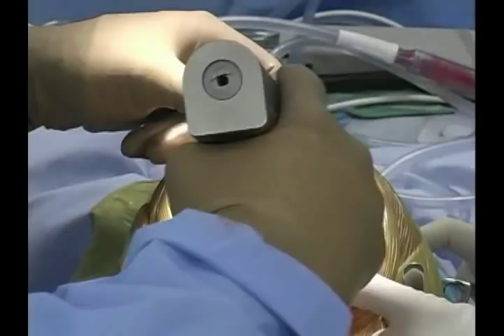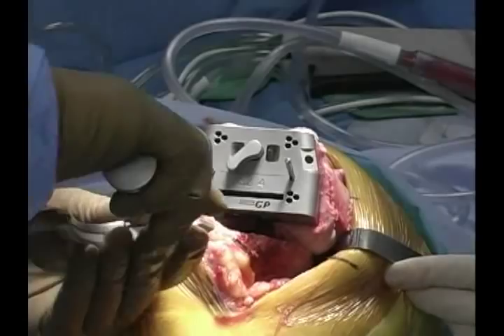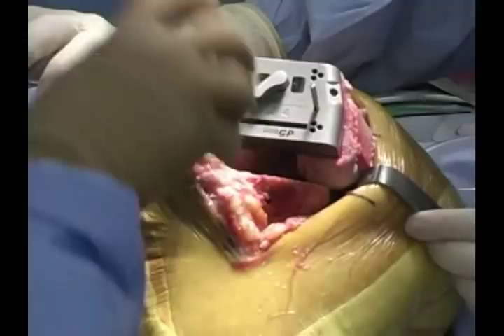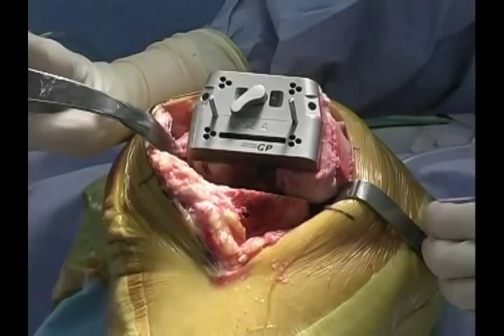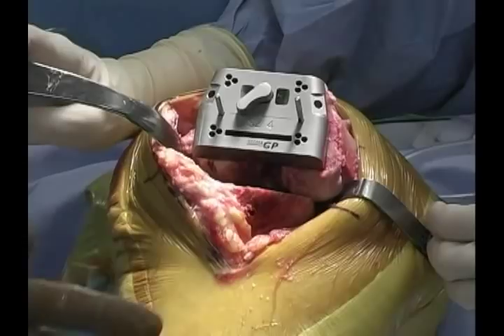This pins the rotation. I can now take the tensioner out and pull the tibial pins out, since I know I have enough resection for a 10 millimeter insert. I'll finish my AP cuts on the femur. Establishing rotation and translation of this block is essentially the key of the procedure — once this is done, the knee is balanced. We've balanced the extension space, established at least a 10 millimeter insert, established the size of the extension gap, and matched the flexion gap to it in rotation and translation. If you anticipate a potential notch, the decision would be to upsize the block.